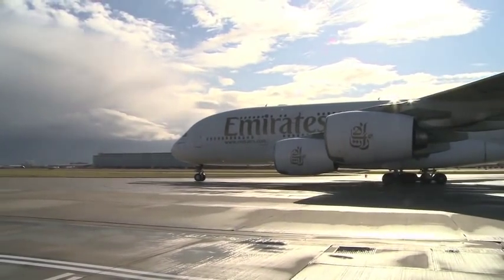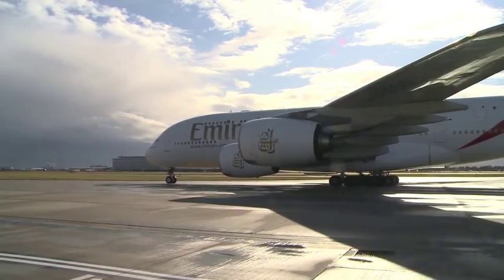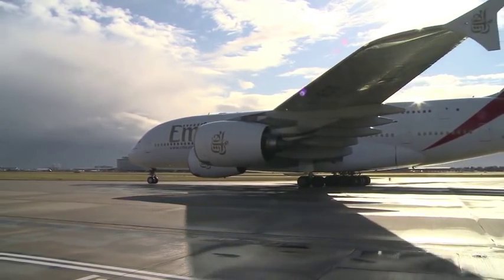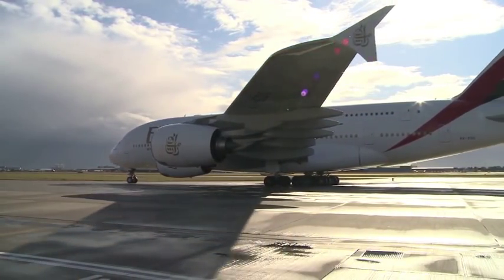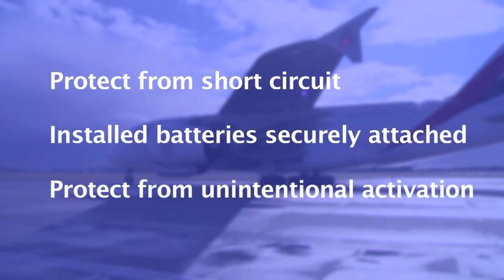International requirements exist to ensure electric mobility aids can be safely carried by air, and how this is done depends on the type of battery fitted. For all types, battery terminals must be protected against short circuit, installed batteries must be securely attached to the mobility aid, and electric mobility aids must be protected against unintentional activation.